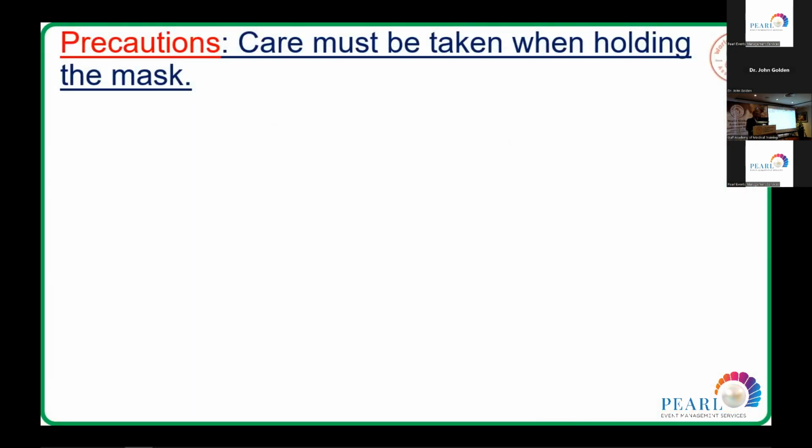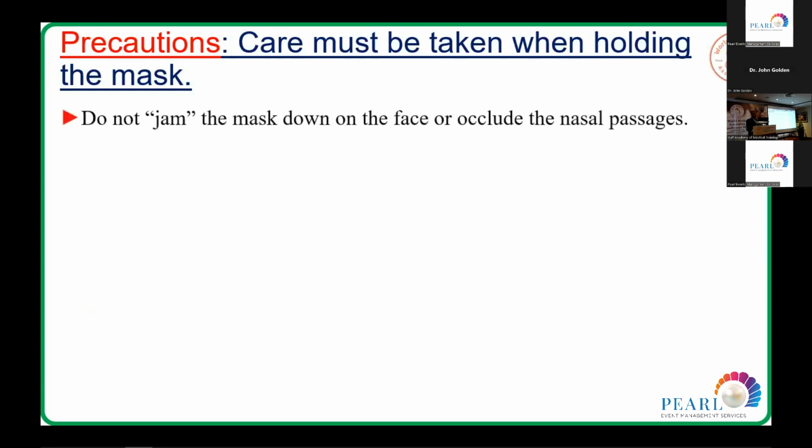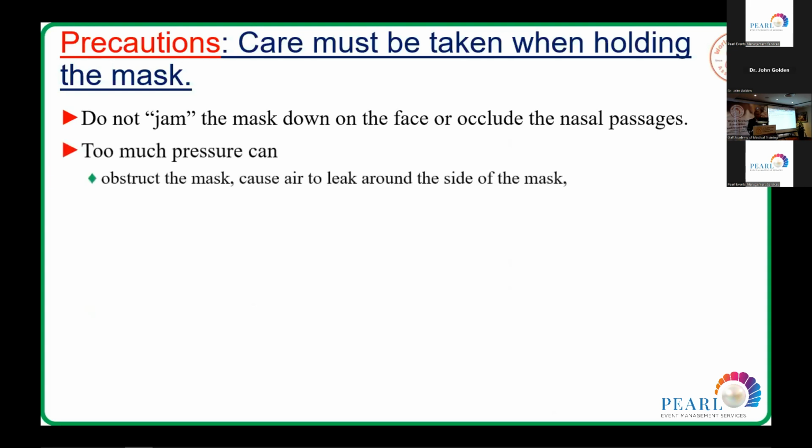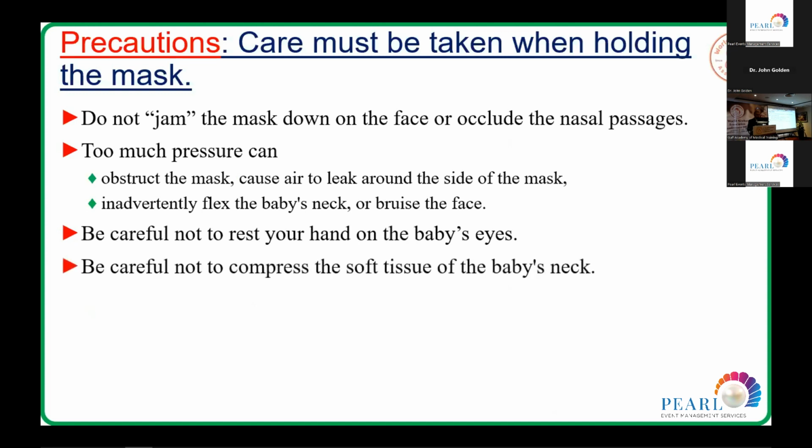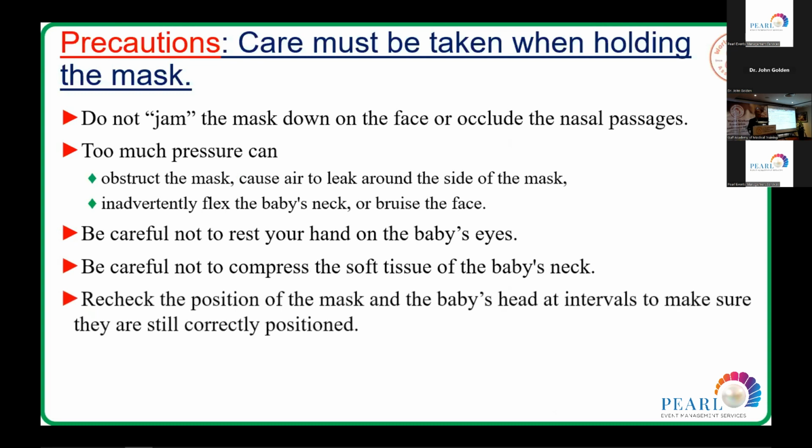Precaution. Care must be taken when holding the mask. Do not push the mask down onto the face or occlude the nasal passage. Too much pressure can obstruct the mask, cause air to leak around the side of the mask, inadvertently flex the baby's neck and bruise the face. Be careful not to rest your hand on the baby's eyes. Be careful not to compress the soft tissue of the baby's neck. Recheck the position of the mask and the baby's head at intervals to make sure they are in the correct position.